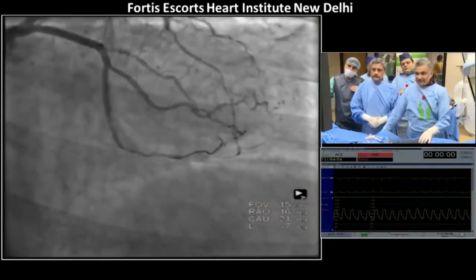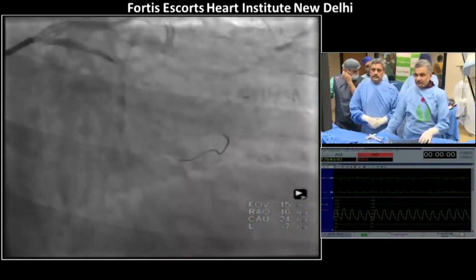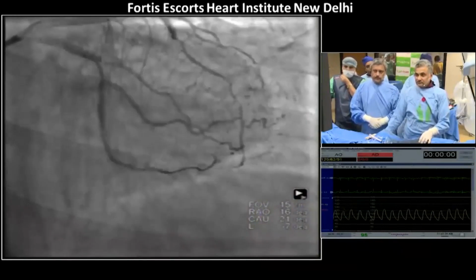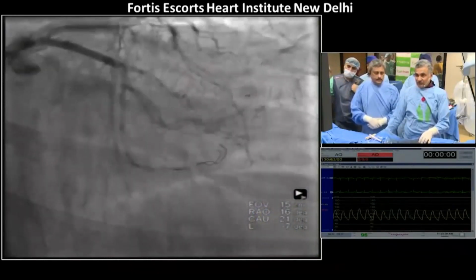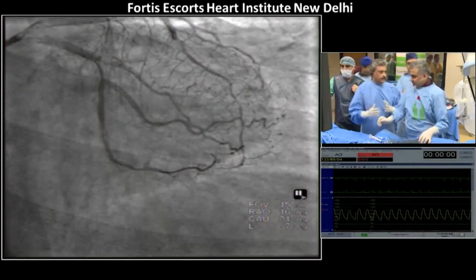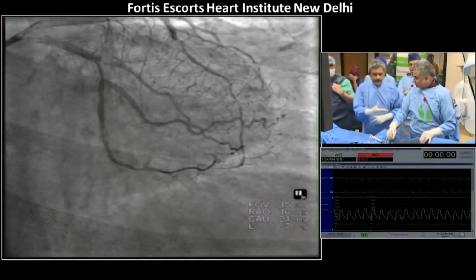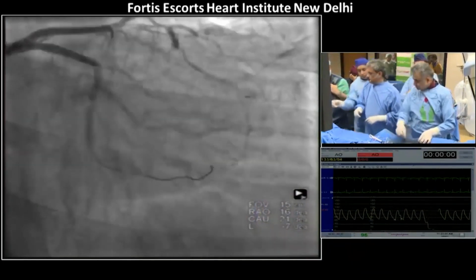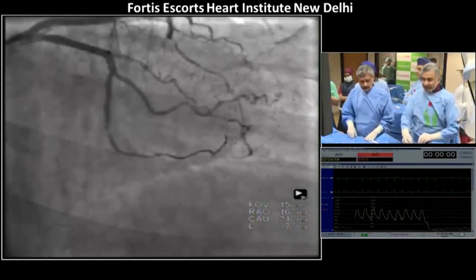That's fine. Only thing is that before putting in a stent, would you dilate the previous stent first? Yes, we would. It is underexpanded. That's the issue. Yes, absolutely. Shall I take an aggressive 2.25 balloon or 2.5 balloon? 2.5 NC. Maybe the distal we will dilate with 2.25, since the artery is not that big. A 2.5 high pressure balloon.